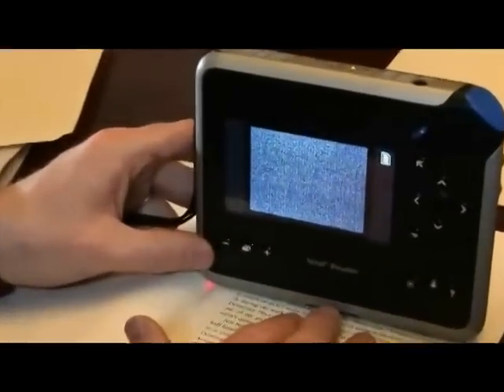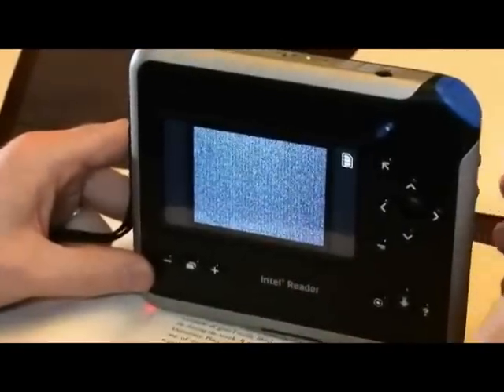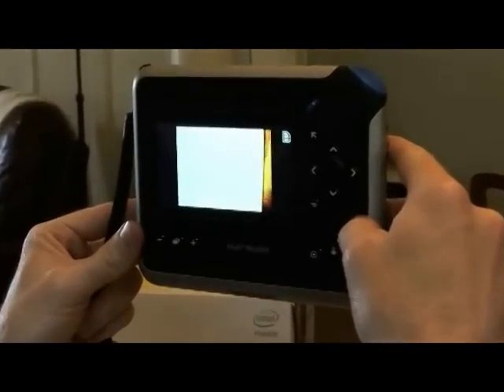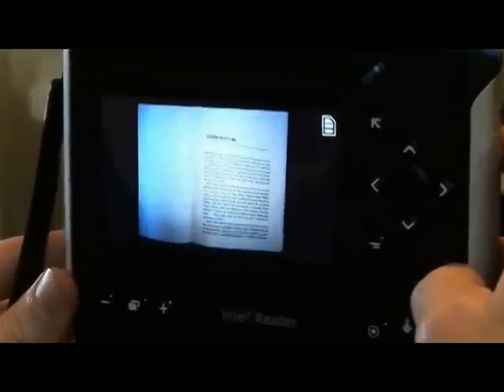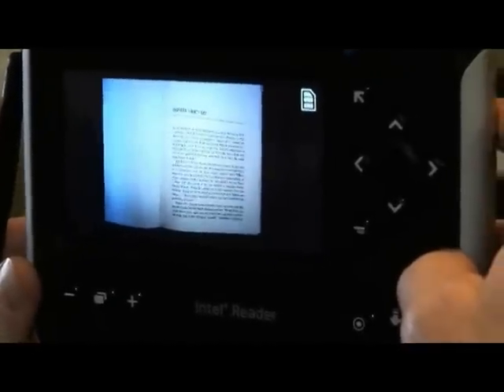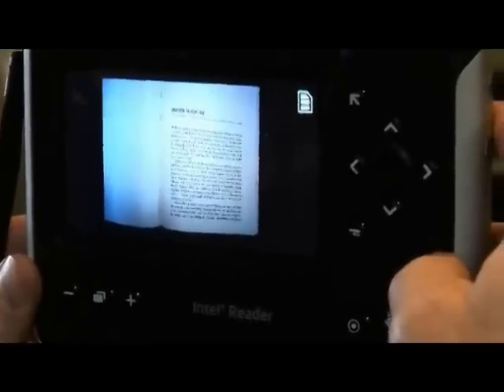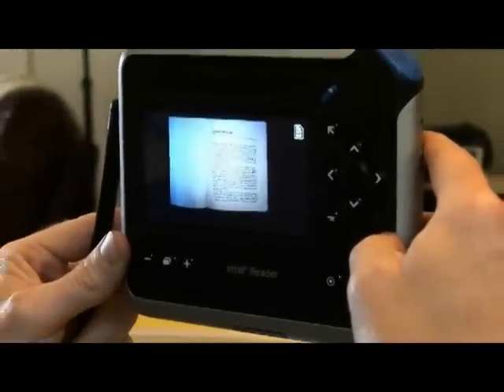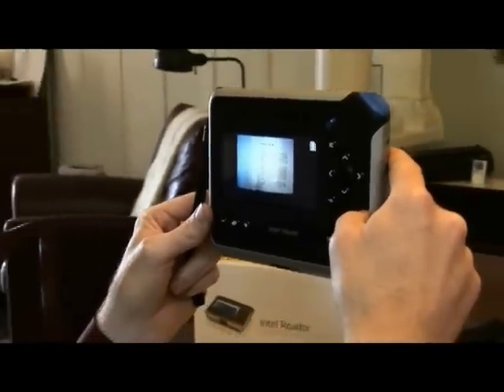Now we're going to talk about some environmental conditions for the camera. It's important with all photographs to have the right lighting. The reader has been built to adjust to room lighting and has a strobe. I've set the reader down such that the camera is in complete darkness, then picked it up — you can see the screen went dark, then light, and then it adjusts to the room conditions. Now we've got a nice crisp image. If you have visual impairments and give yourself a few seconds, the camera after about 15 seconds will tell you 'press shoot to capture an image,' and you can be confident the camera has adjusted.